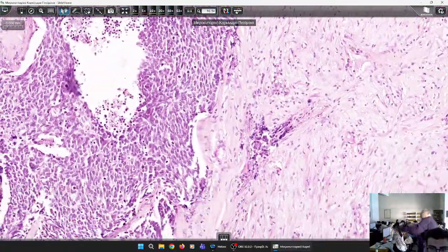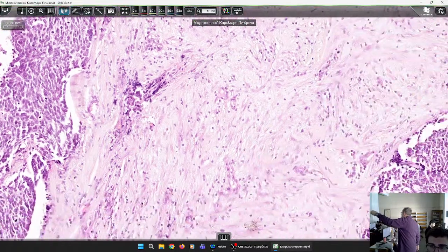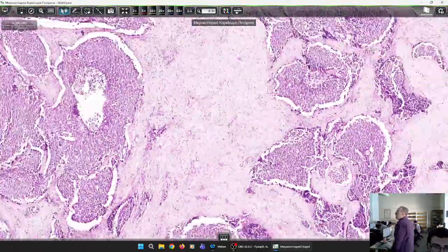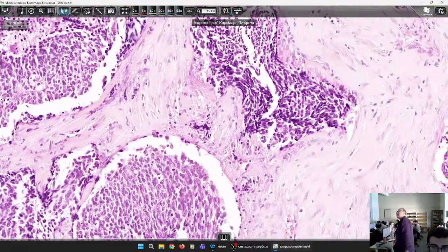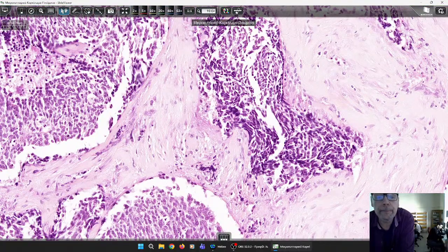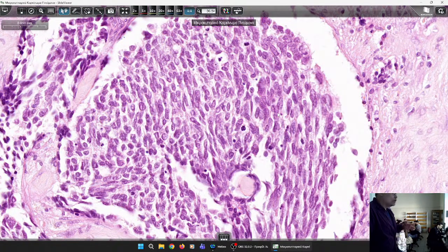The other here on the right is the somehow desmoplastic or fibrous stroma of the tumor, that the malignant cells have altered their stroma and make it some sort scirrhous, that means fibrous stroma. But look at the malignant cells themselves. Let's have a look here. What do they have? They look like each other. They are not atypical with nuclear pleomorphism. They look like each other.